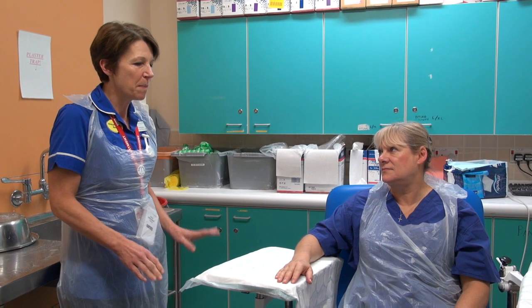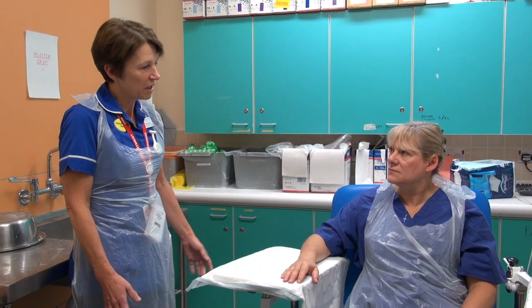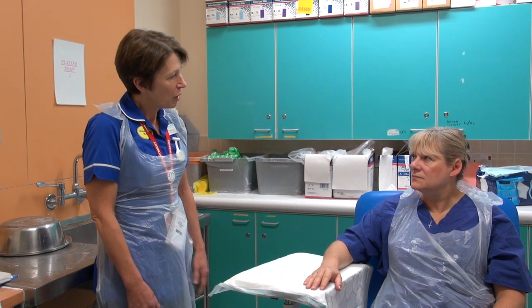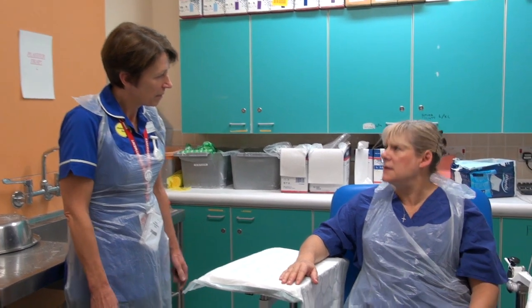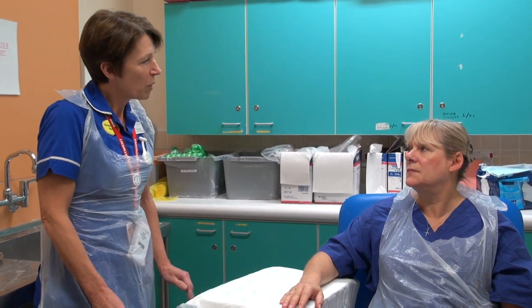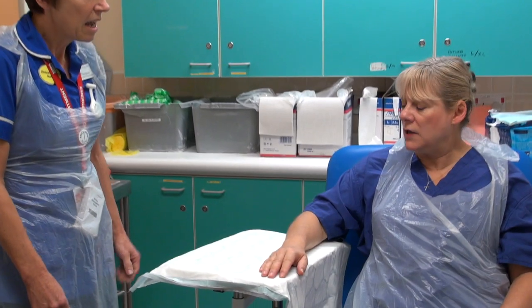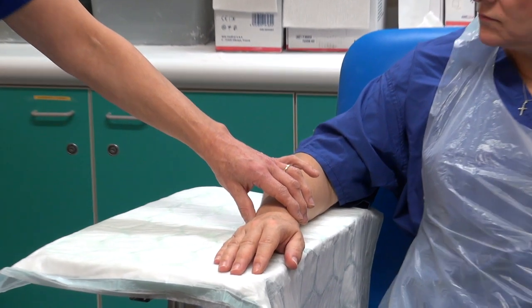We're going to start off using the basics of plaster application. I want to make sure Mag is comfortable and hasn't got any pain. So how's your pain at the moment? Not too bad at the moment — I've had some pain relief. Do you understand what we're going to do? We're going to put a back slab on your wrist today, because you have a break in this wrist area here.